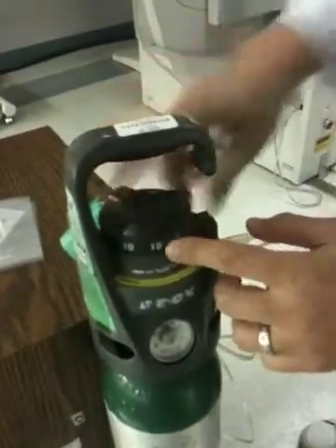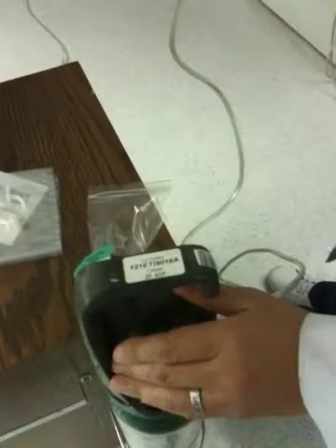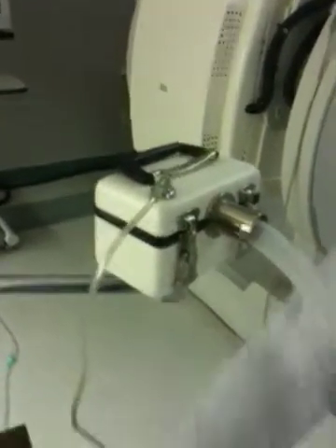Inject, close it, and turn it on, okay? The flow rate is 10 to 12 liters per minute. Turn it all the way to 10 — not 15, because 15 is going to pop it up; 15 is too strong. So 10 to 12 is okay, whether you use a wall outlet or otherwise. After you inject, then you turn it on — don't turn it on first, because then how are you going to inject? So: inject, have the patient put the mouthpiece on, put the nose clamp on, then start the air.